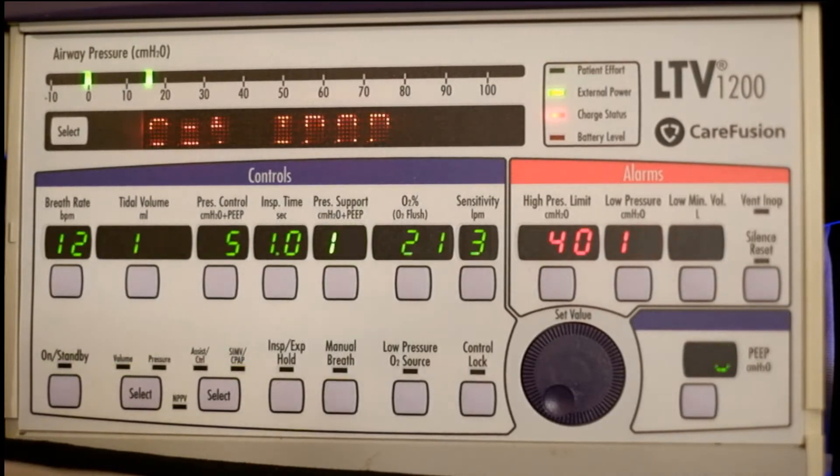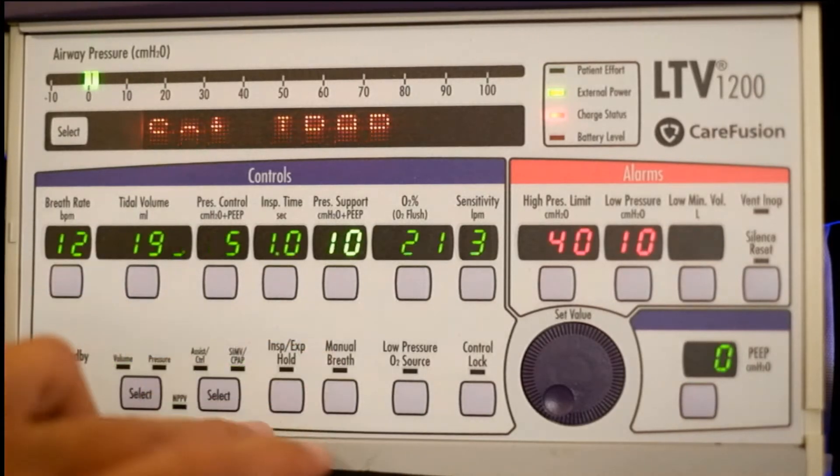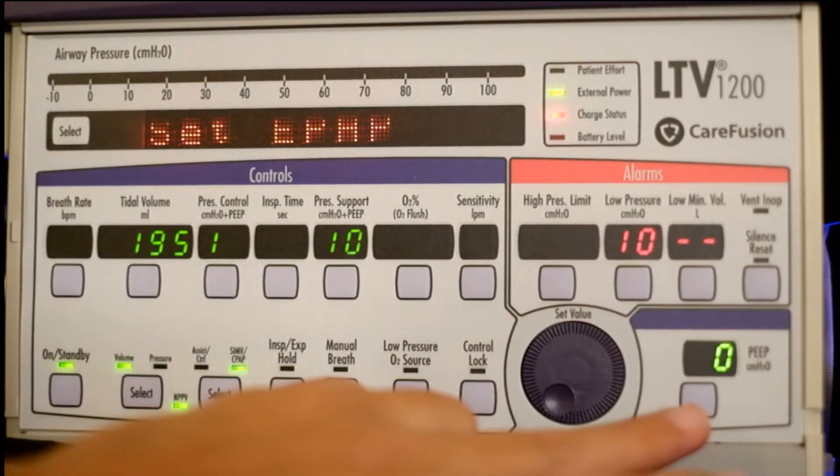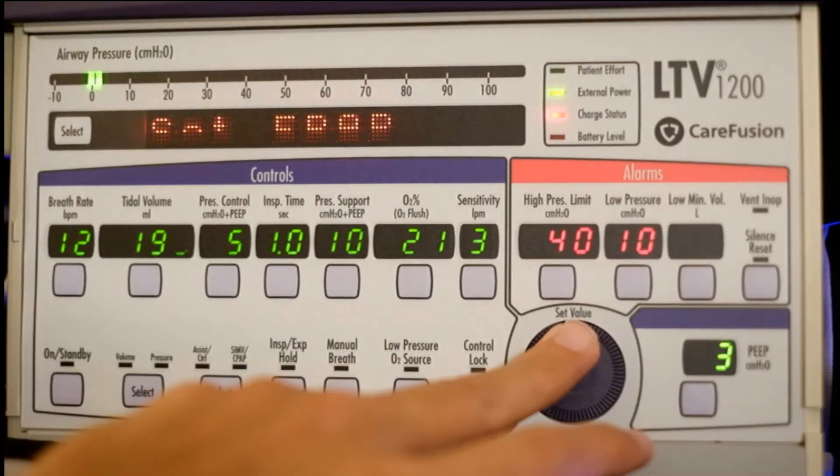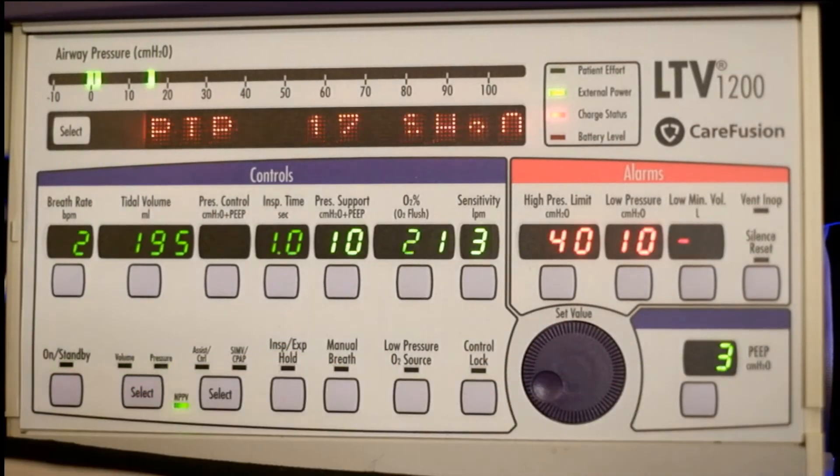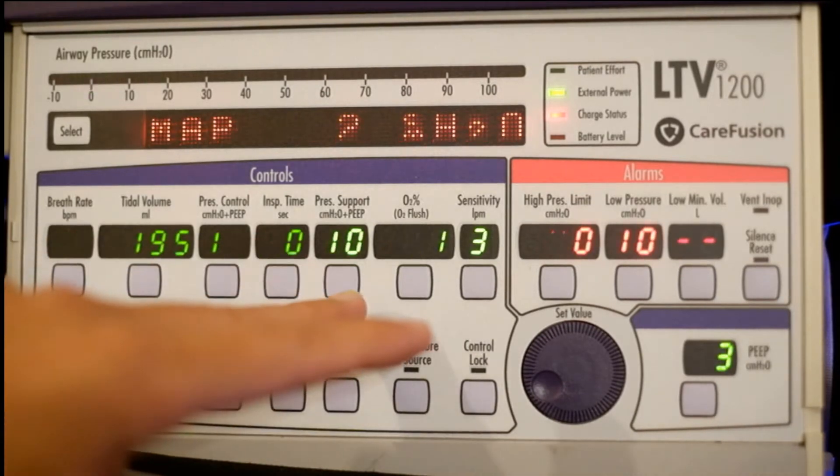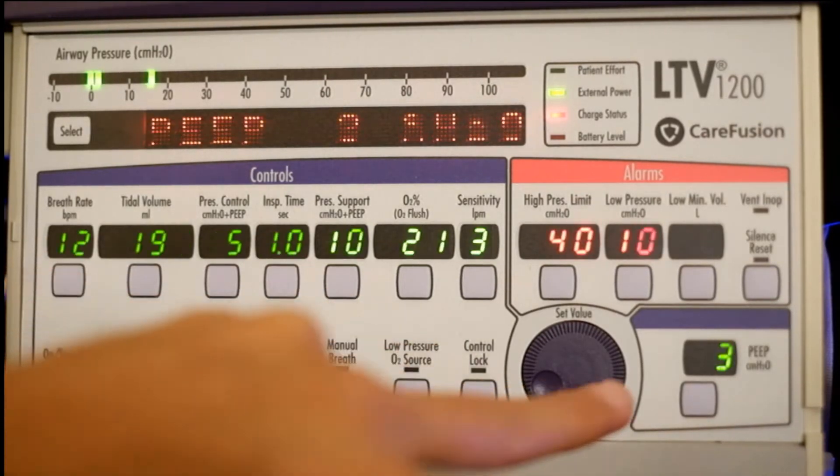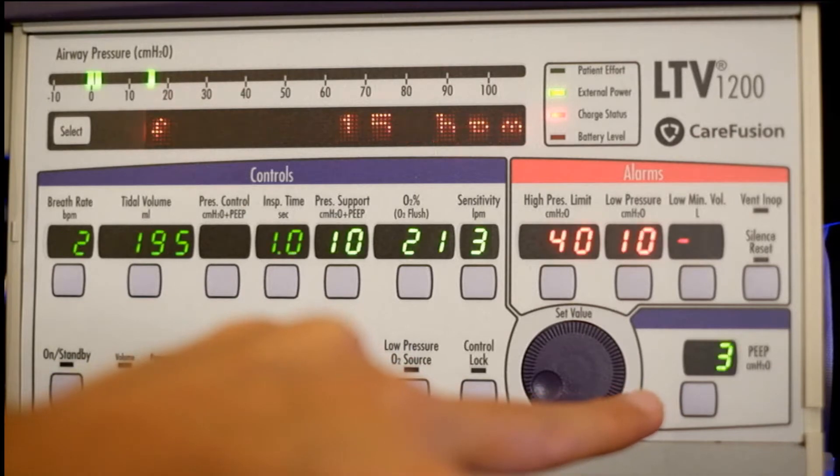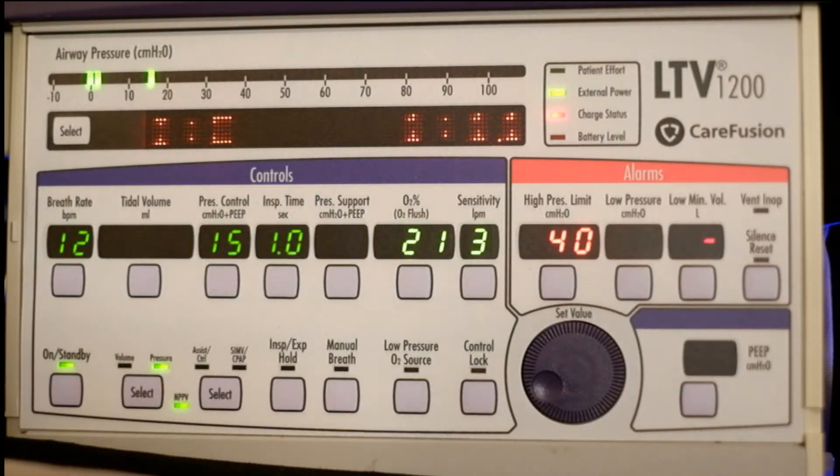So the first thing it's going to ask you is to set the IPAP. IPAP is basically pressure support, and EPAP is PEEP or CPAP - they both mean the same thing. We'll set the PEEP to three. So now the patient is receiving 13 of pressure support over a PEEP of three. Remember, that pressure support is IPAP and PEEP is EPAP.